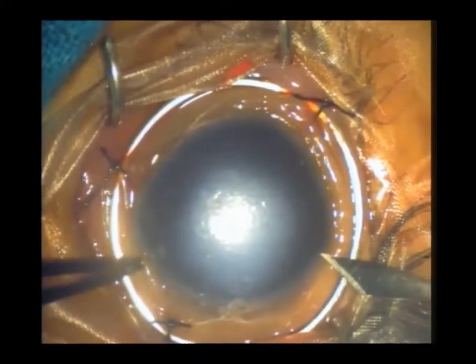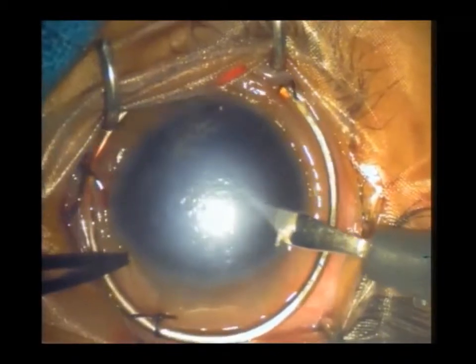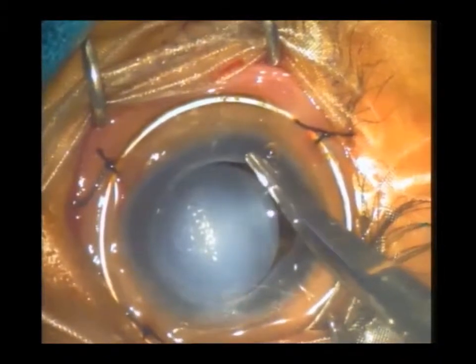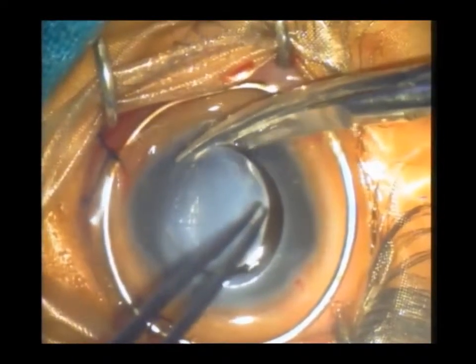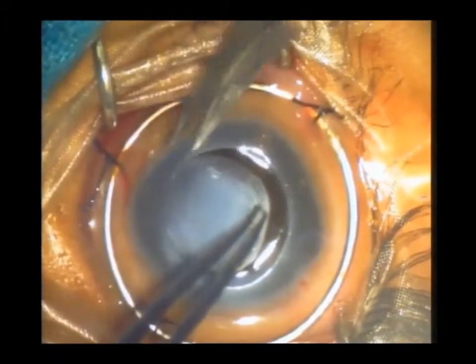A side port is made to inject viscoelastic into the anterior chamber. This prevents trauma to the lens and iris during trephination. The recipient button is then trephined with the help of a 6.5 mm disposable trephine. The excision of the button is then carried out with the help of curved corneal scissors.